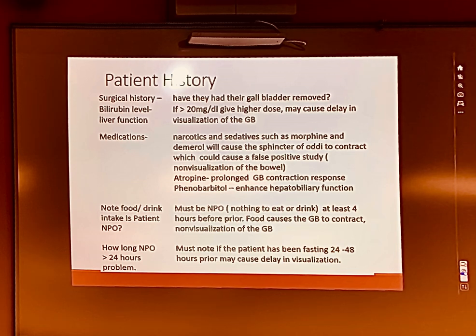So your patient's history. When you get this exam, you're going to say, what is the surgical history of this patient? Okay? Have they had their gallbladder out?